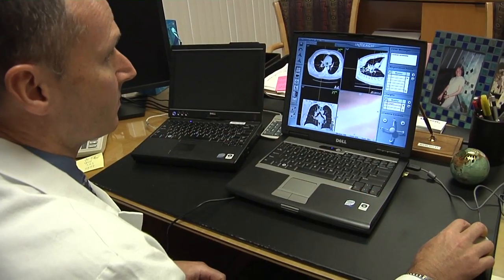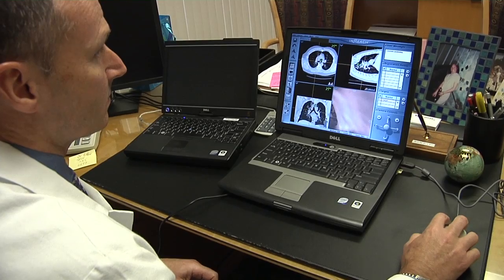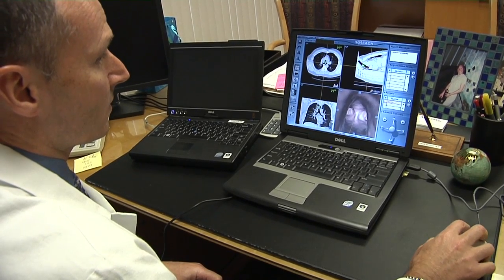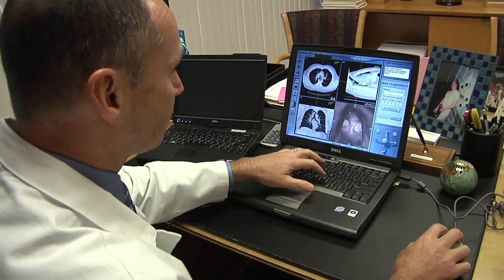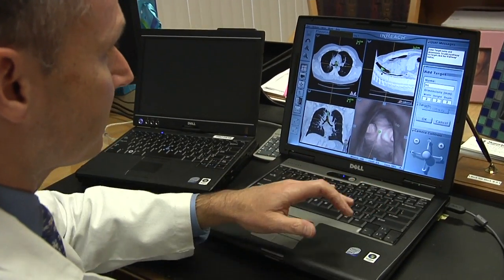It's a technology that uses computer guidance to help us use a bronchoscope to find lesions in the lung. Typically, a bronchoscope has a camera on the end, so when we put it into the windpipe, we can see the main windpipe and some of the big airways. But the problem is that most tumors are farther out into the lung, and we can't get there with just a camera. So even though we have an ultrasound bronchoscope, that only looks at things surrounding the windpipe.